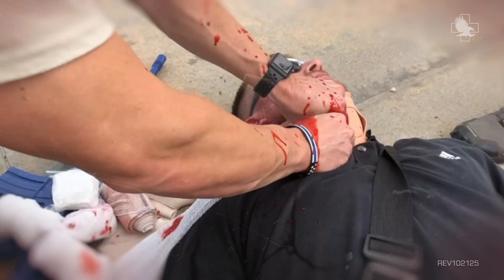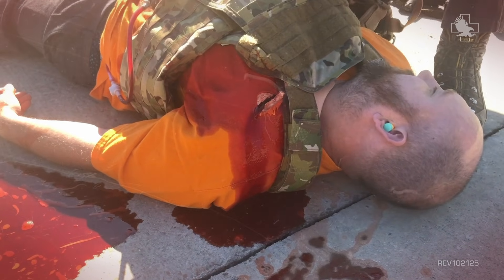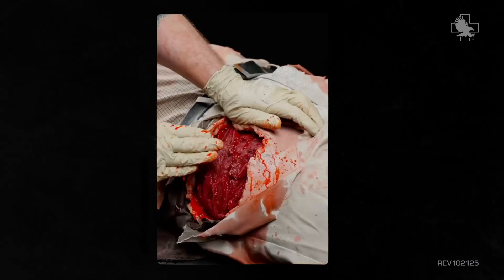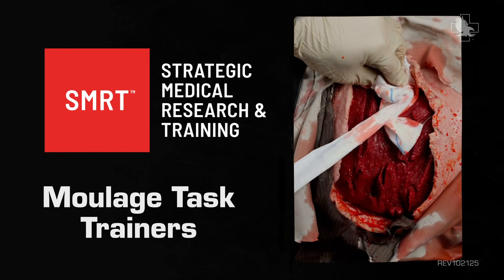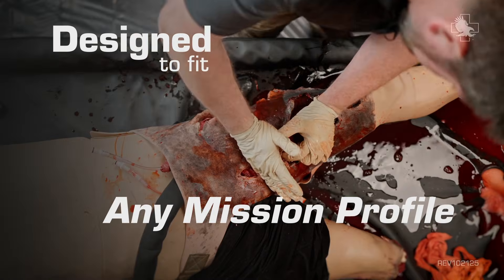When every second matters, make every second count. Introducing Strategic Medical Research and Training Moulage Task Trainers. SMRT Moulage Task Trainers are designed to fit any mission profile.